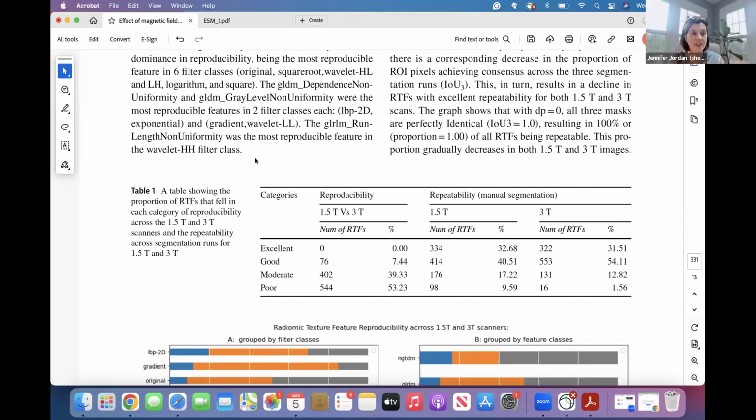Yeah, this is a great question. Certainly in the commercial software, there is the ability to increase that offset to 10% or so. That is definitely where we saw the most effects, on the border zones. So again, standardizing the analysis, trying to keep an offset or an automated analysis, should hopefully improve the repeatability that we see in some of these radiomic features.